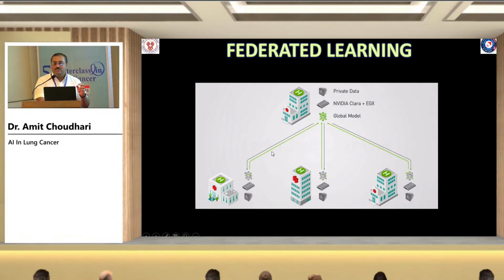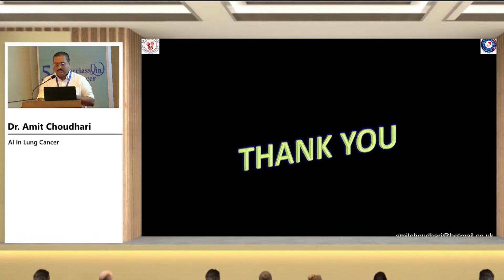And again, this model is what is shared back to this central server, so that one comes to what is known as a consensus. So that whenever we have this newer model which now encounters, say, a newer pathology or pattern type, it can very well recognize that pattern even when that comes to an area which is not really endemic to that set of disease in a scenario. So that is the new kid on the block, which is federated learning, which also involves transfer learning.